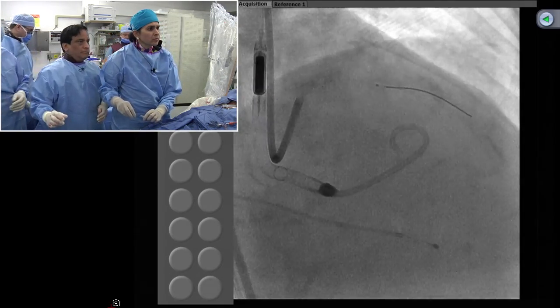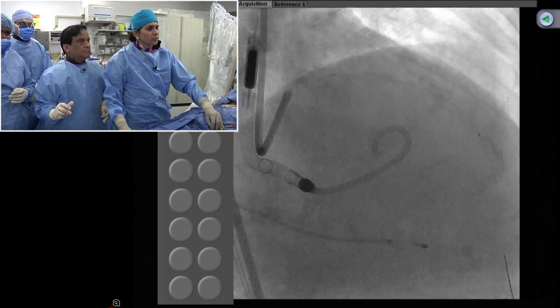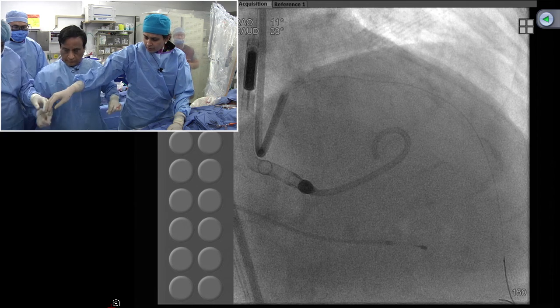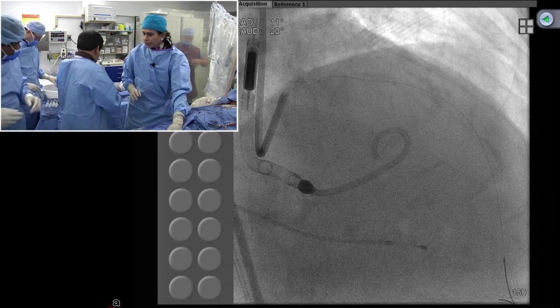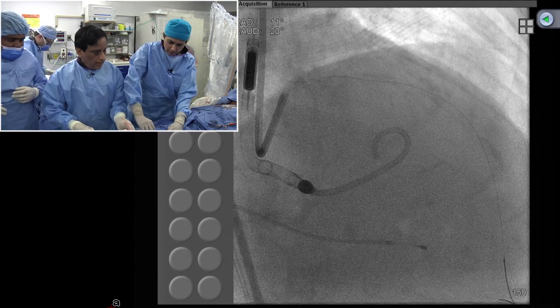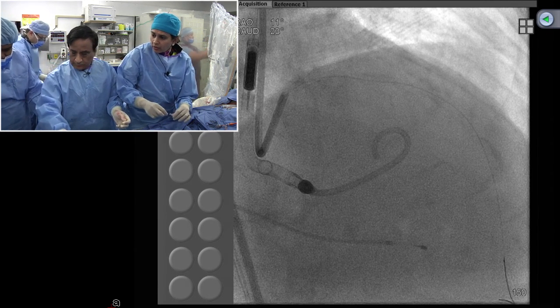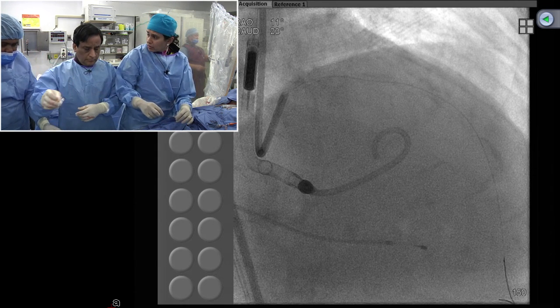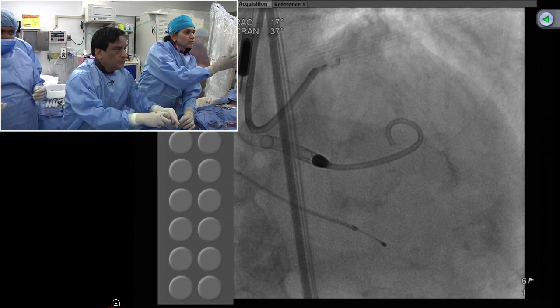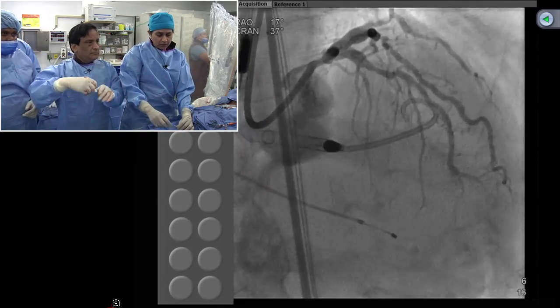The younger people — I can guarantee you that rotational atherectomy will come to the forefront right in their thinking. That just shows how hard it is to wire these lesions sometimes. You just got to be patient. I just don't think they have to do sequential cutting balloons up-down, up-down. What's your thinking? Well, I agree with what has been done so far because of the low EF and rotational atherectomy — you need some kind of support. I think you were in the right direction.